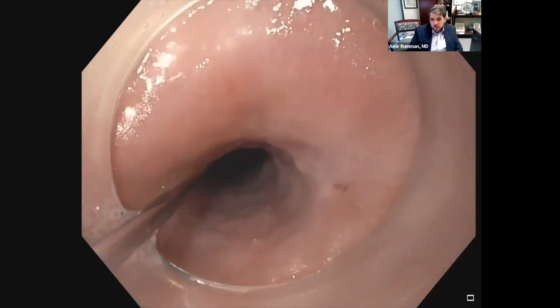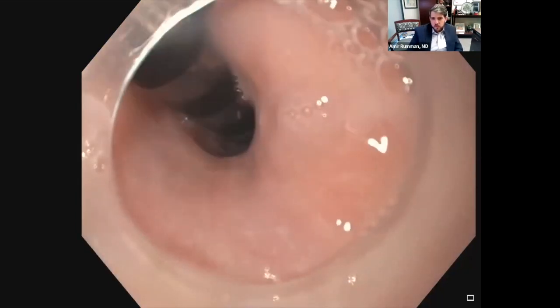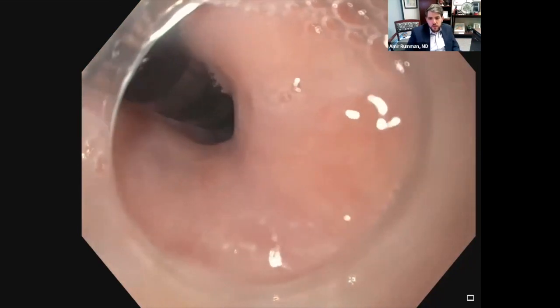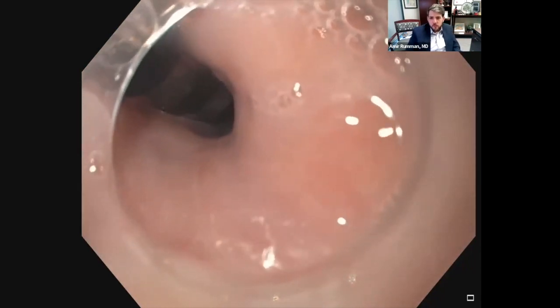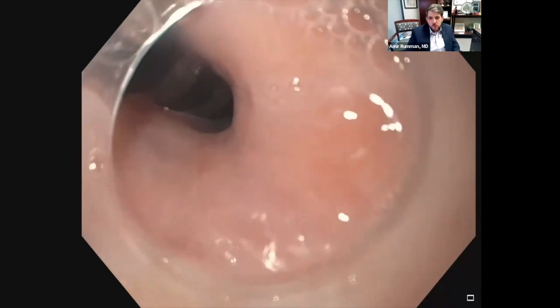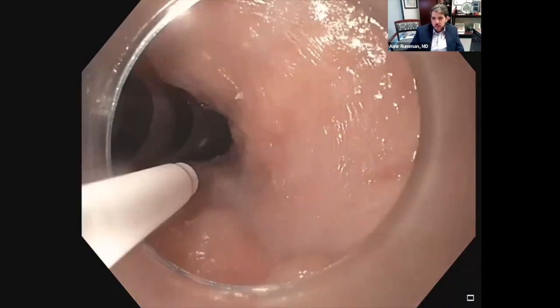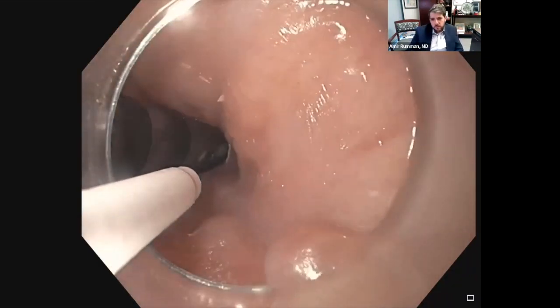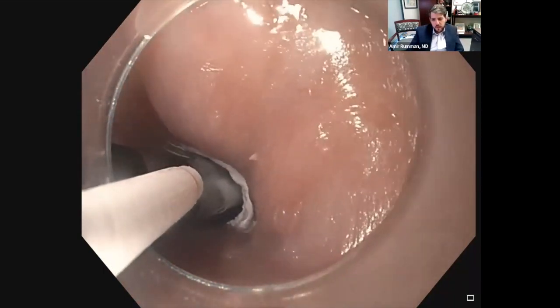Here we are passing a Savary wire and we're able to get our venting tube over the wire. We're positioning the venting tube so that these black notches are straddling the stricture. The stricture is probably around 15 or 20 millimeters long.